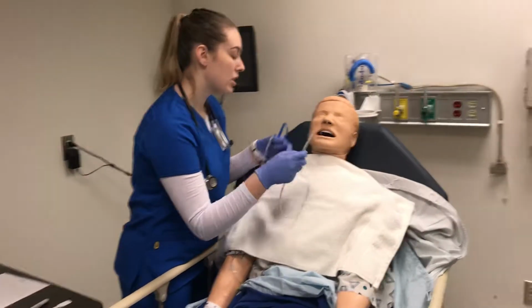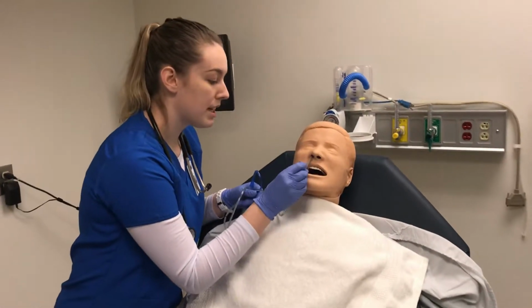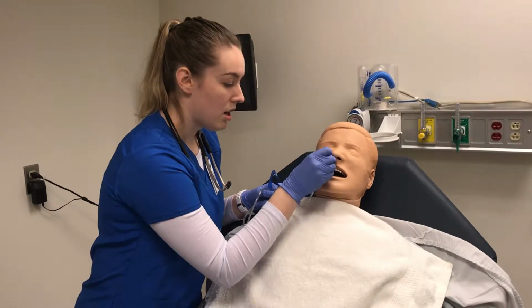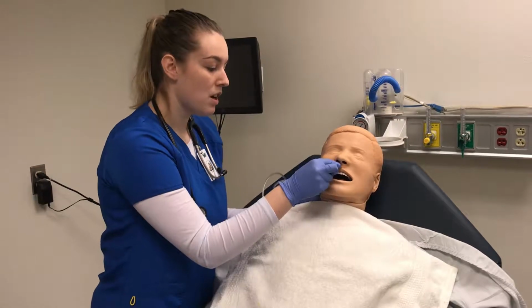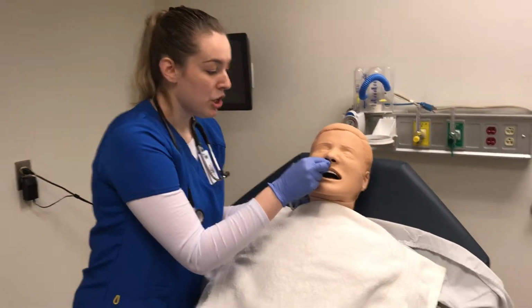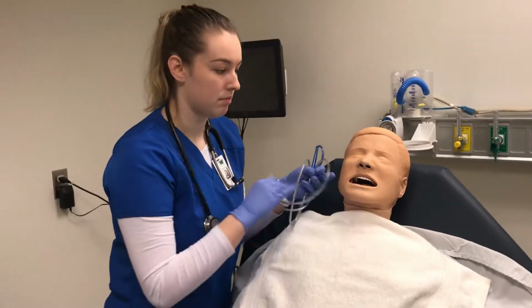Okay, Shirley, I'm going to insert the tube now. Okay, so I'm just inserting it. Okay, and now I hear Shirley gagging, so I can pull back 1/8 of an inch. Are you still okay, Shirley? Thumbs up? Okay. So now I'm going to put your head forward. So our head would be forward.